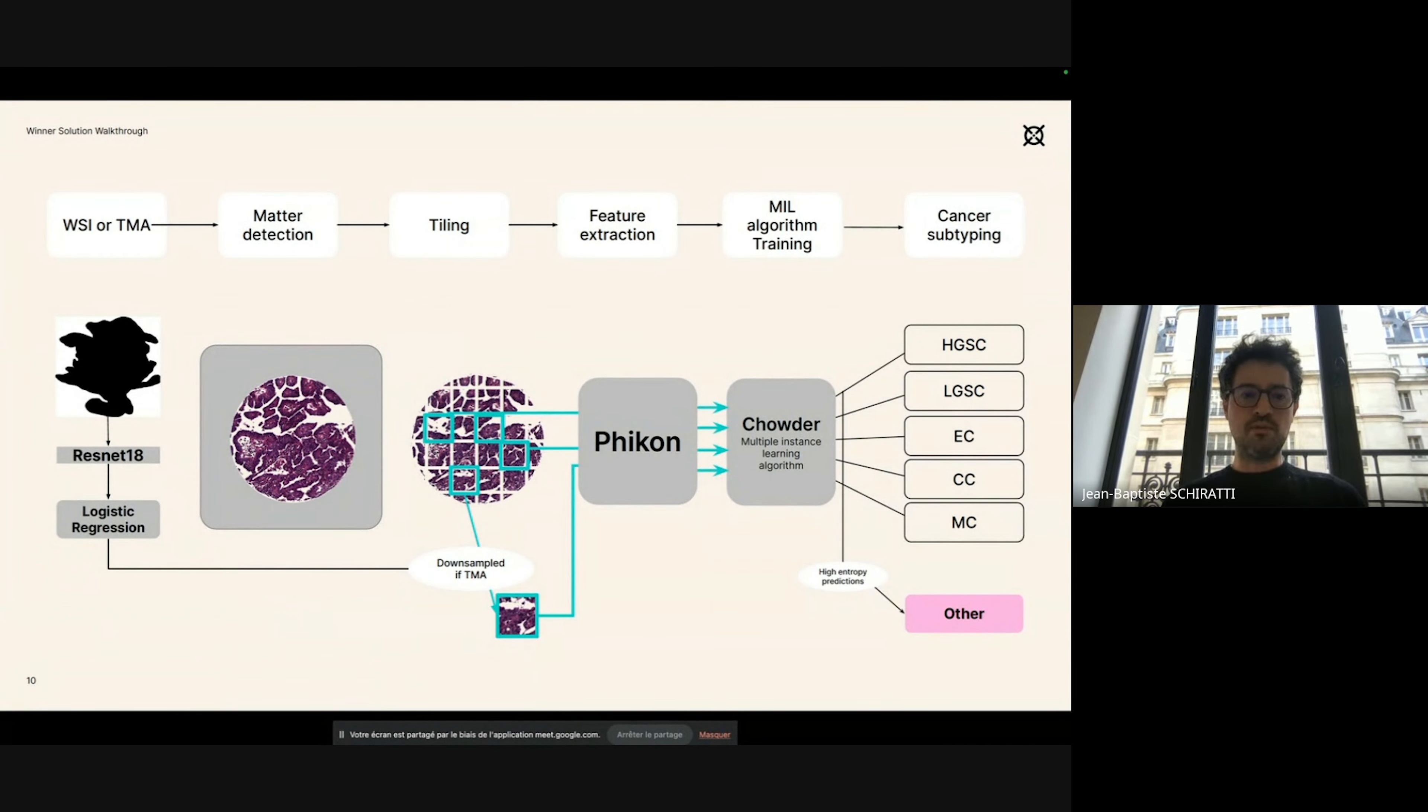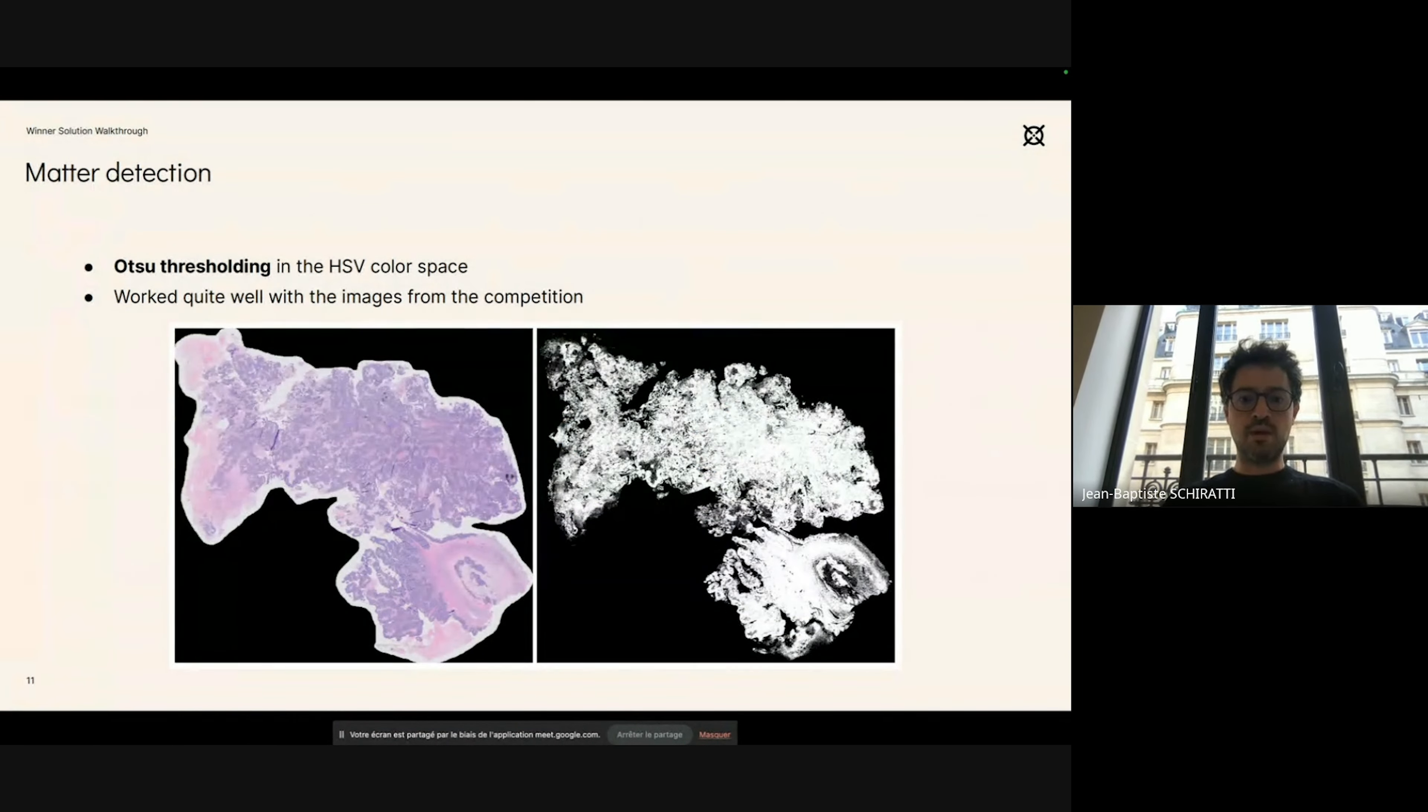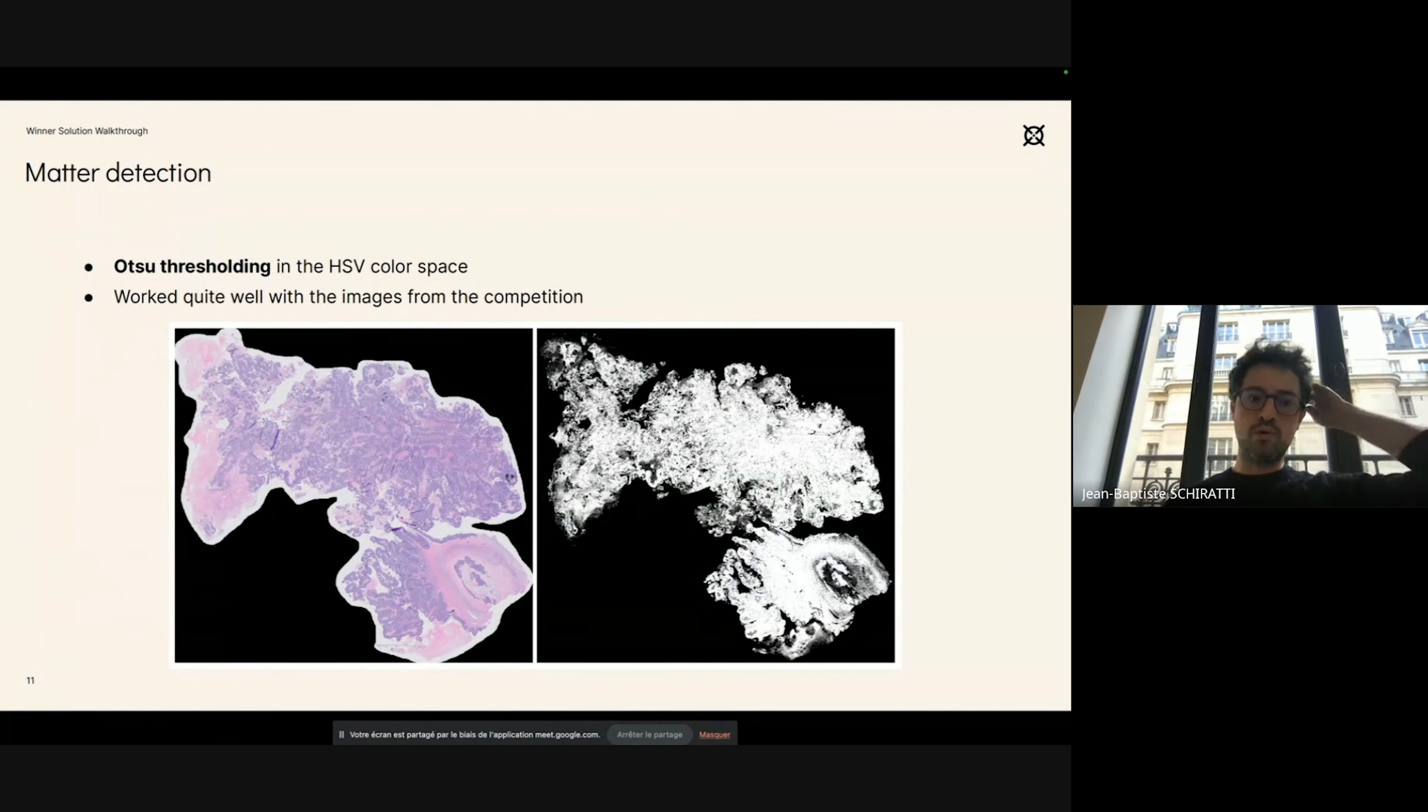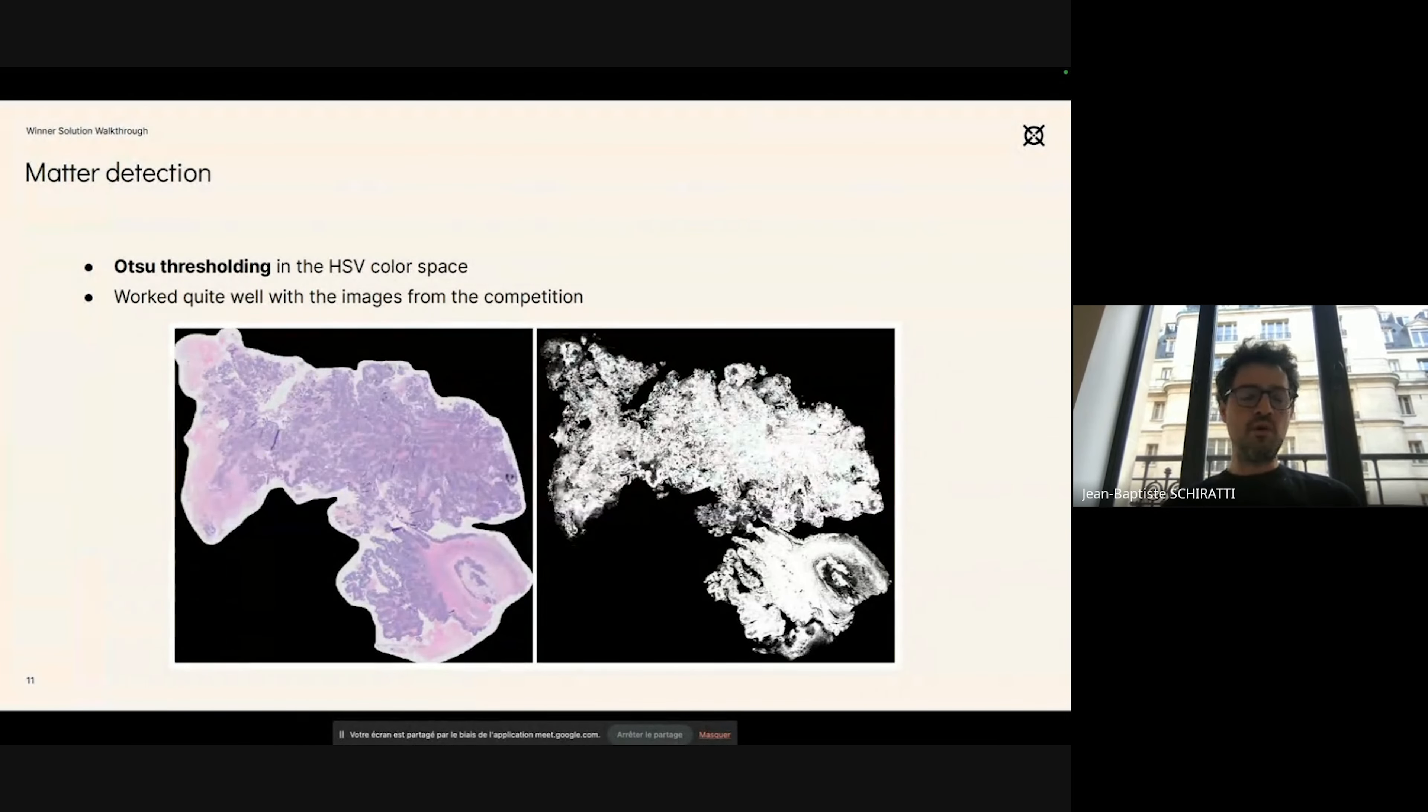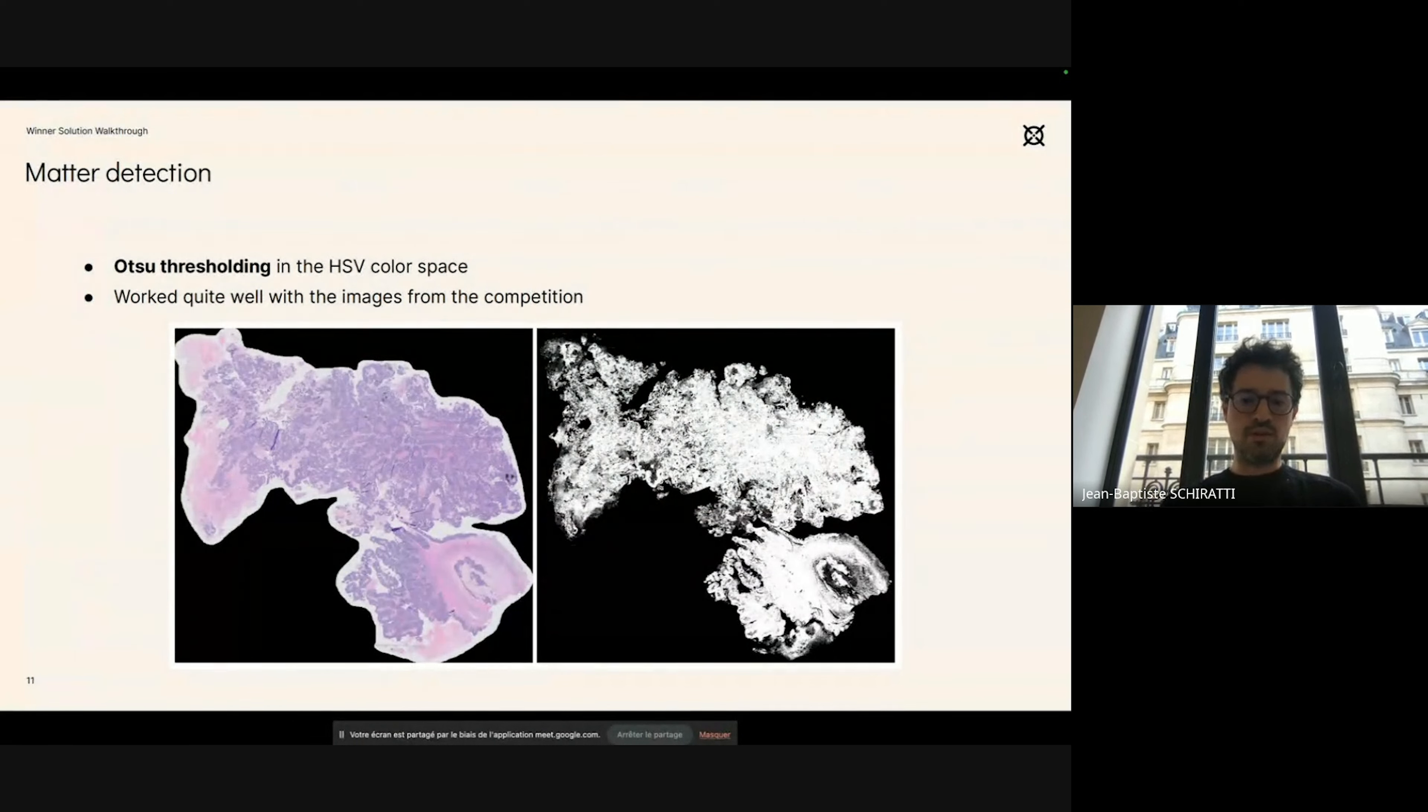As I mentioned, one of the first steps in our pipeline is to be able to detect the parts of the image that actually contain matter, not background. To do that, we used a method called Otsu thresholding in the HSV color space. It worked quite well. It might not work that well for other types of staining, for instance IHC staining, but for the images in the competition we were quite satisfied with the matter detection, as you can see here.